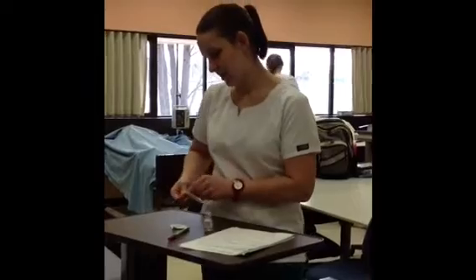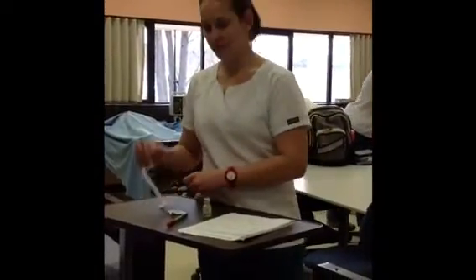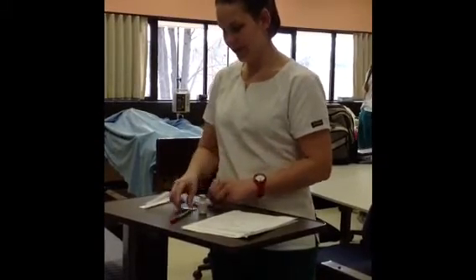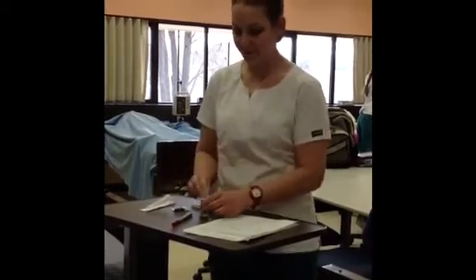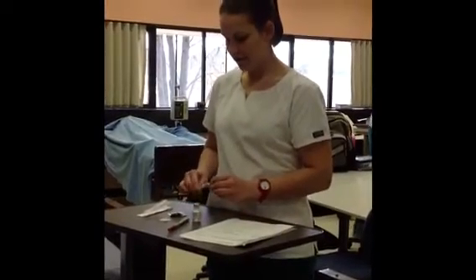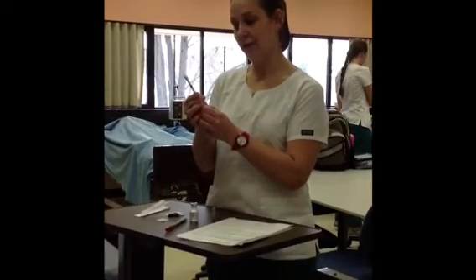I have my 27 gauge needle. It has a syringe with a half-inch needle. I'm going to just clean the top of the vial here, ampule. I need 0.5 milliliters, so I'm going to draw that amount of air up, and then I'll eject it in.